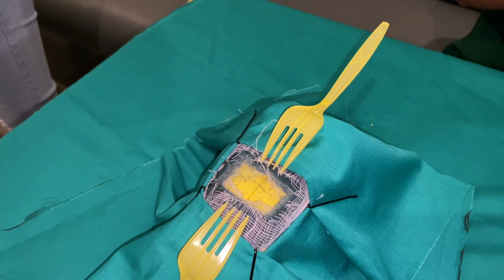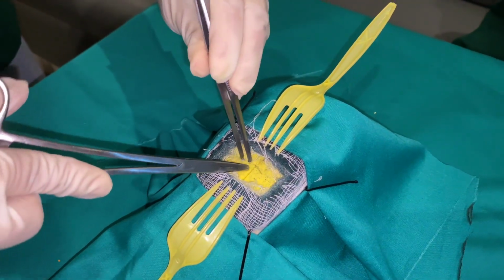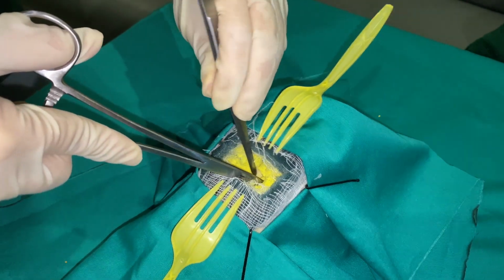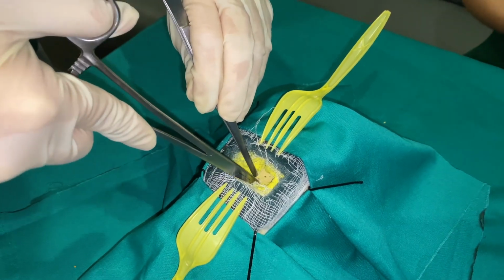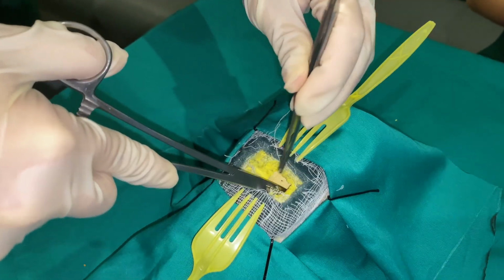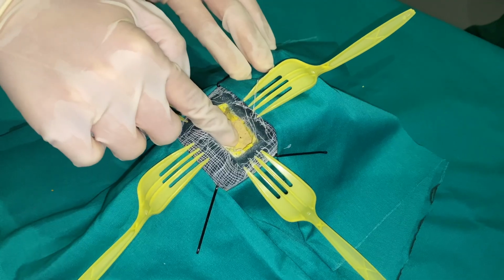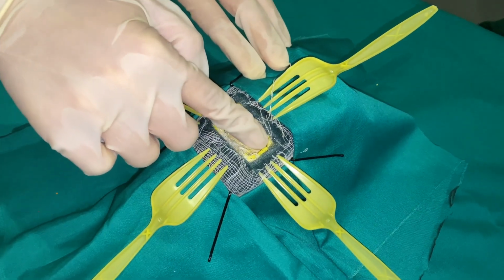You can now identify the midline cervical fascial plane between the sternohyoid muscles. Divide this intermuscular plane by spreading. Repeat this maneuver to separate them and retract the muscles laterally. Now the trachea and the cricoid can be palpated.